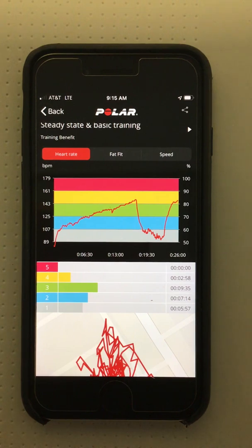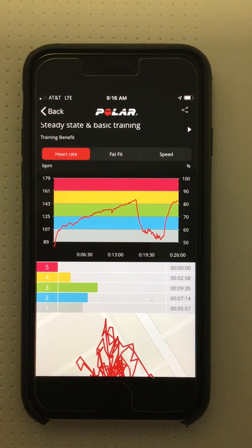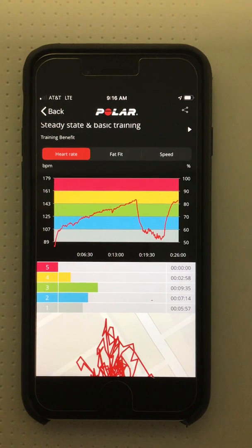The red bar at the top indicates the amount of time in the very high zone, exceeding 90% of this patient's heart rate max, which would be considered an unsafe cardiovascular intensity. This patient clearly did not spend any time in that training zone.